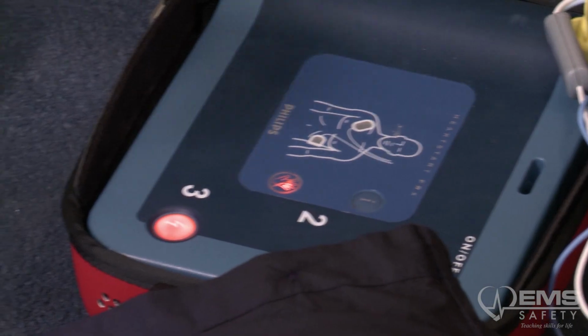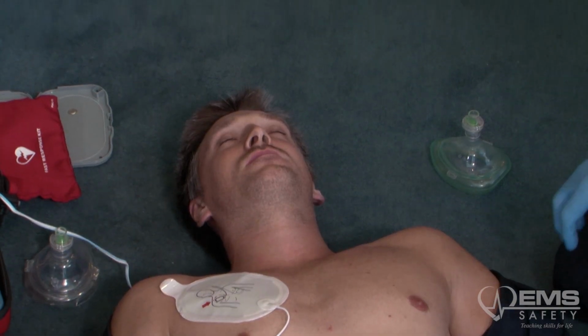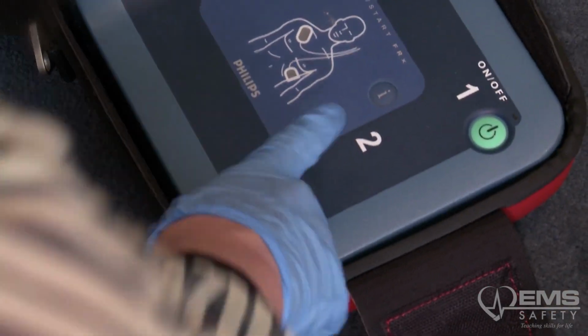Everybody clear. Analyzing heart rhythm. Shock advised. Stay clear of patient. Press the flashing orange button now. Shocking. Shock delivered.